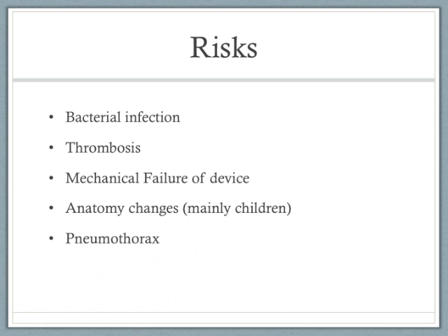Another risk is mechanical failure. It's very rare because the septum is made of a self-sealing silicone, and it can withstand hundreds of punctures before it becomes weakened, and usually the device does not fail, but it has been known to happen.